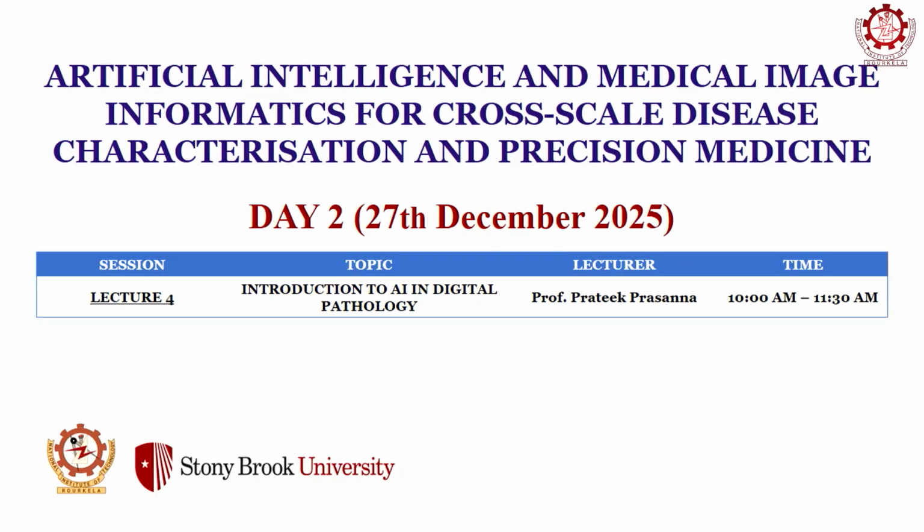Now in digital pathology, you take that slide and you digitize it, and then instead of the pathologist having to look at it under the microscope, they would look at the computer screen, look at the image, and do whatever analysis they have to do later on. So in the course of the next hour and a half, we will cover some of the fundamentals of digital pathology, especially computational pathology. What are the advantages, how these can be used, and how in fact this is a paradigm shift in the domain of pathology.